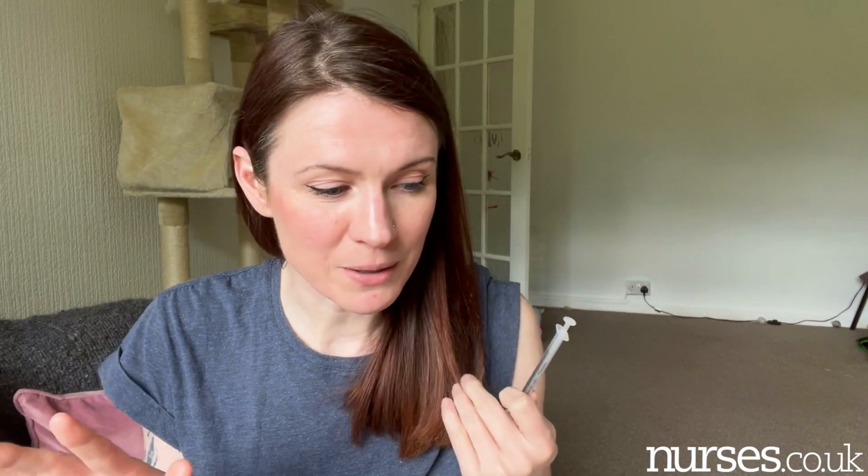Another thing to be mindful of when you are giving injections is hitting someone's bone. I have done this myself. It's easily done. You misjudge something, you go in that little bit too far, and you actually feel it. Very fortunately, the patient has never felt it. I know I've gone wrong, but they've never made a comment about it, and I've just apologized, and they're like, oh, I didn't even feel it. So I've been very fortunate like that. And the intramuscular area is, well, you can see mine quite well on here. That little shape there, that is my muscle.